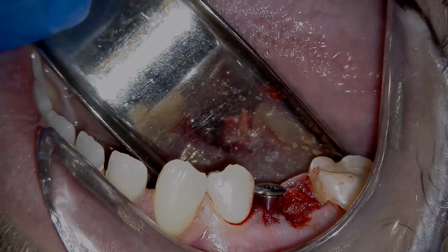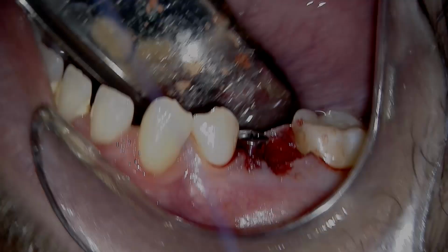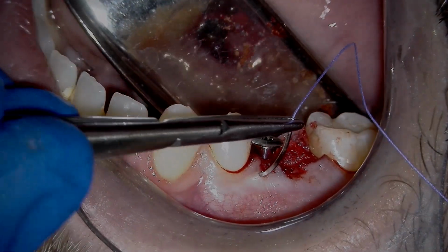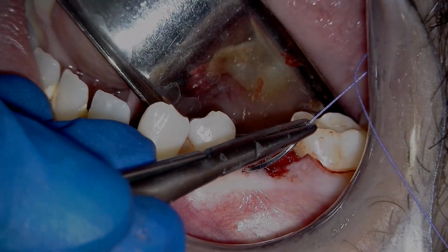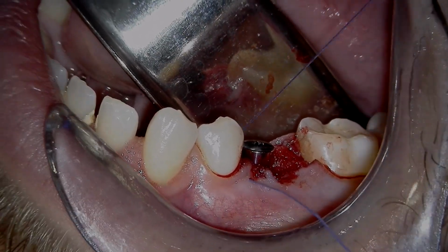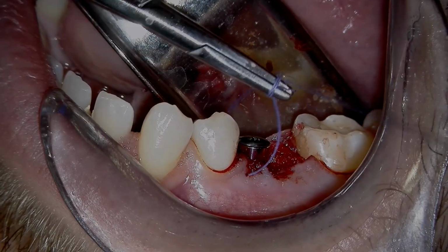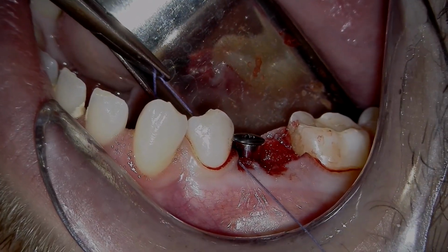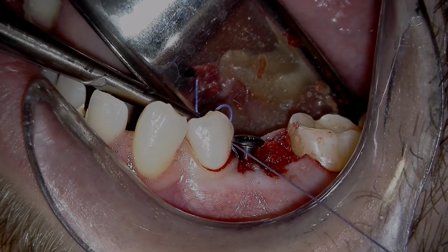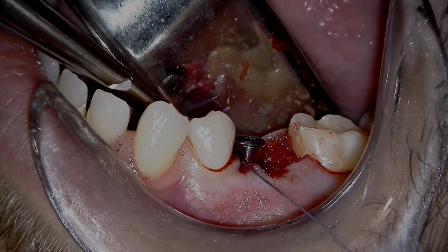Next, I'm going to put in a couple interrupted sutures. I'm going to start with the mesial just to kind of bring the buccal lingual tissues together. This is not under tension. I'm not trying to get primary closure. This is a secondary intention technique. But I'm going to go through the keratinized tissue of the buccal, engage the lingual tissue, and it's a basic interrupted suture. So let me tie this into place. I always like to make sure my knot lays flat. If you pull it the wrong way, it will kind of ball up on you. Keep that flat. Great, one more. All right, we're halfway there.